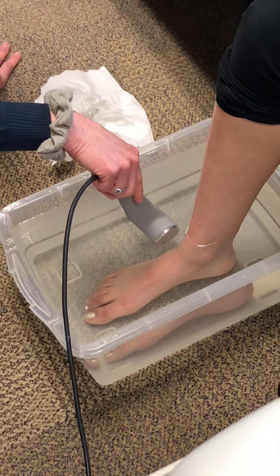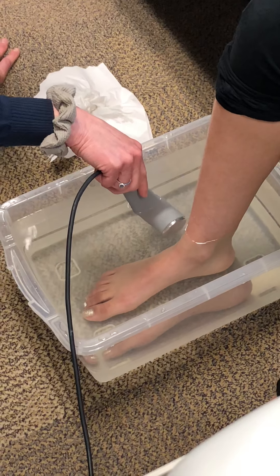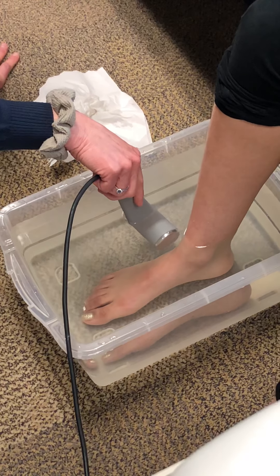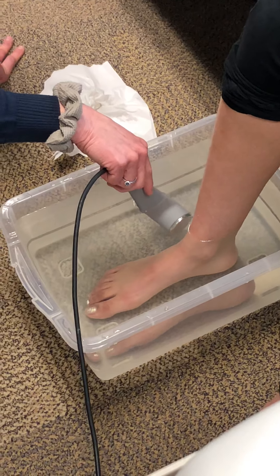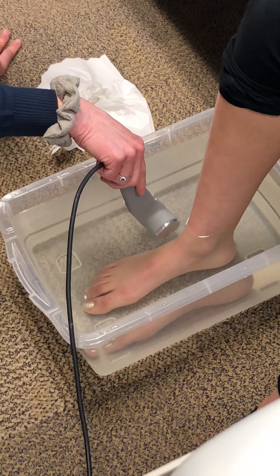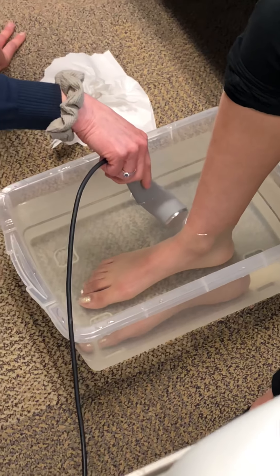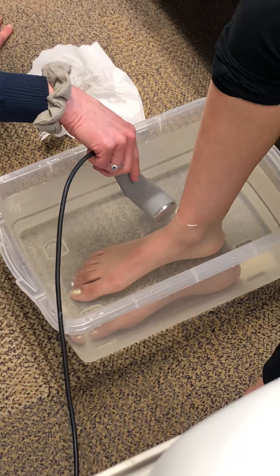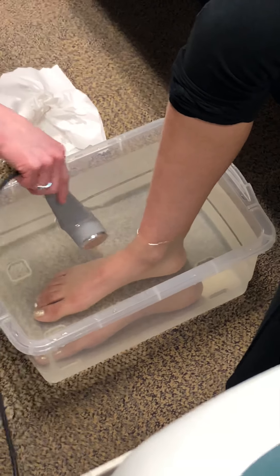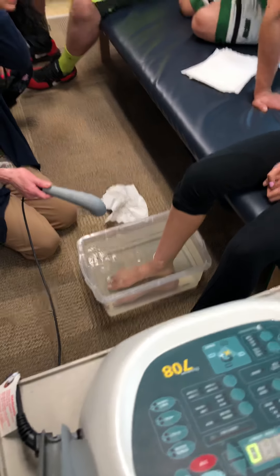And that's why you have to increase the intensity by 50% — because there's a little space there and it's not totally in contact with the tissue. Can you stop it? Stopped. And literally that's how easy it is.